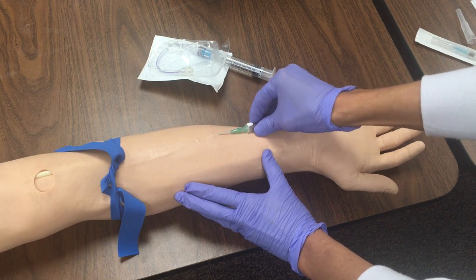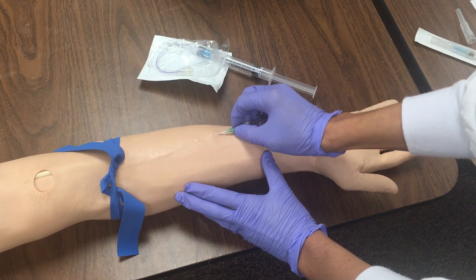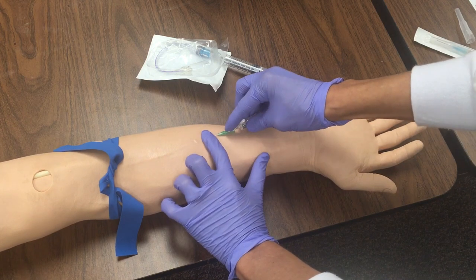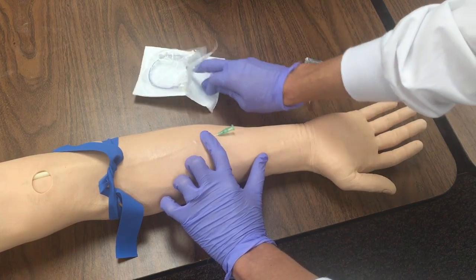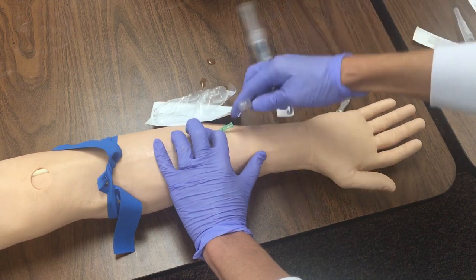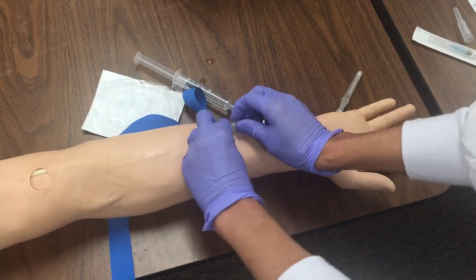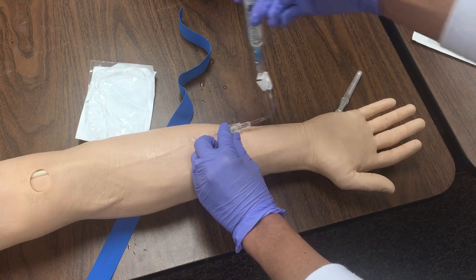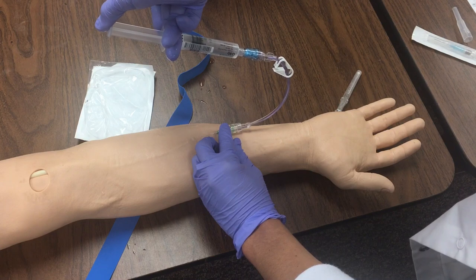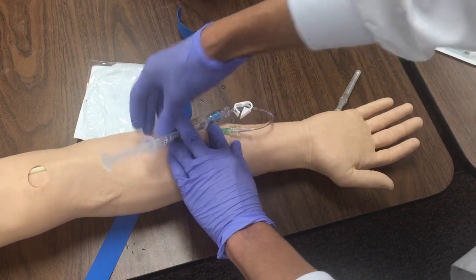Begin the insertion with the bubble up. When you get blood return, start advancing the catheter, which is the green part. It's a little bit challenging on the mannequin because it's thicker. Now you want to place pressure at the end so that it doesn't bleed when you take it out. Attach your extension tubing. Release the tourniquet. Flush, and then pull back and make sure you get blood return. Obviously this is a mannequin, so I'm not going to get blood return.